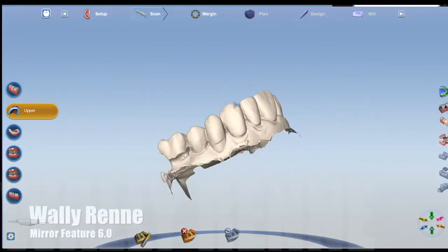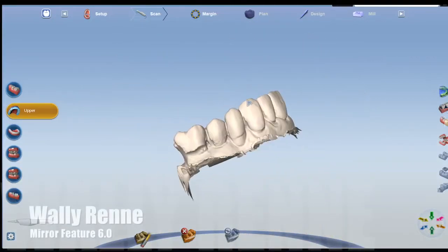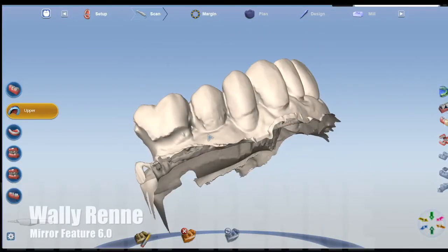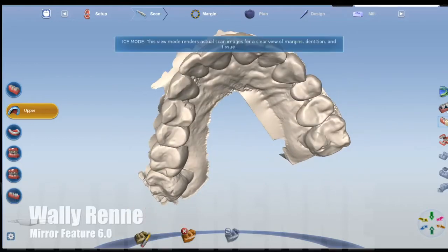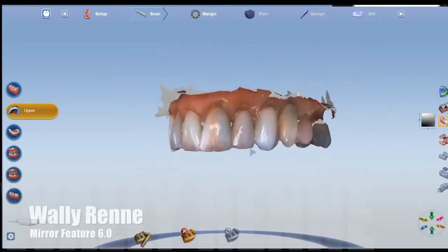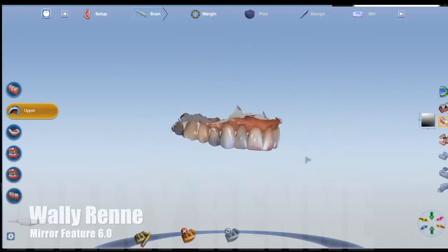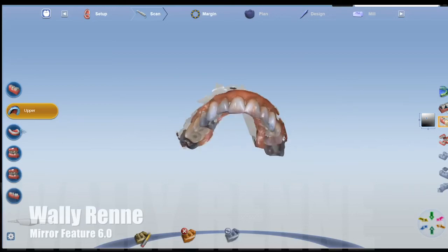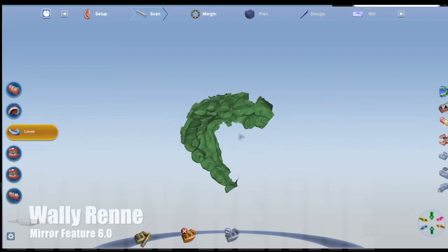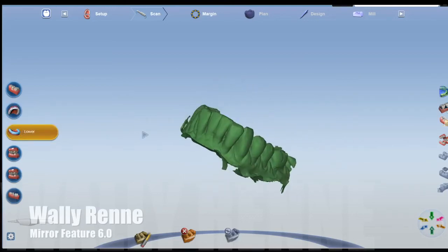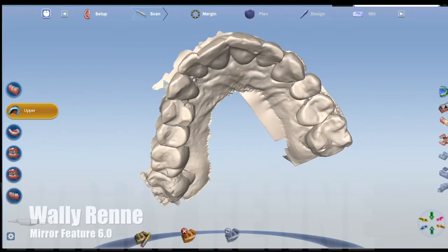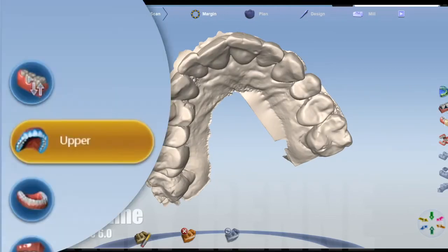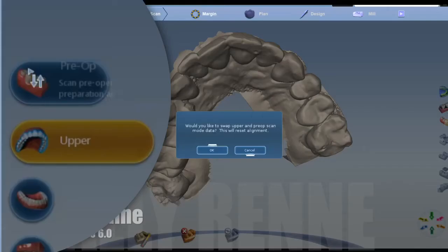Hey guys, I just wanted to show you something really cool in the 6.0 update that I've been playing with. Here's a patient that came in for a new patient exam and I just did a quick scan. It's not perfect, but usually when I'm doing these quick scans, they're not filling in every little nook and cranny — they're more of a diagnostic type scan. So the scan times are around a minute.